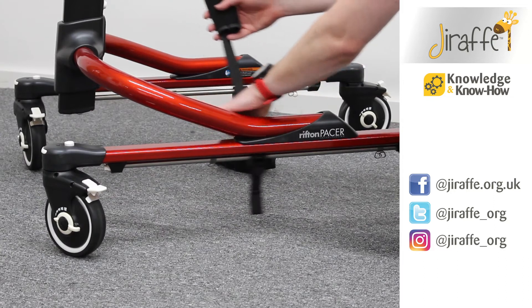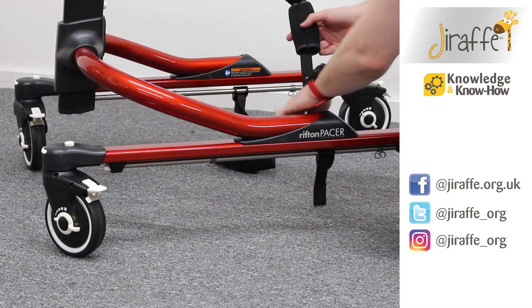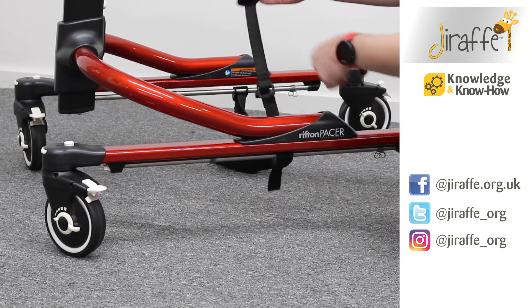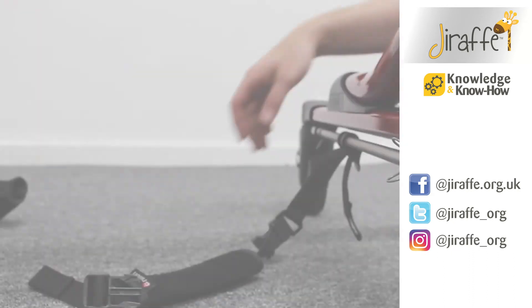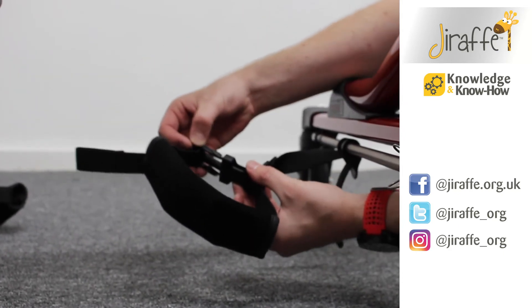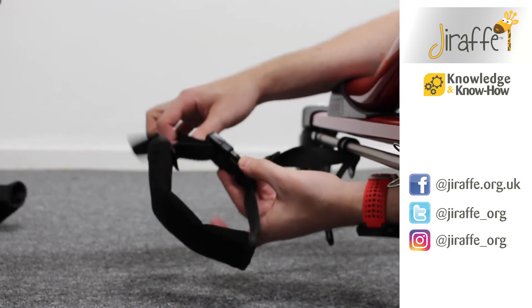The ankle prompt itself has got a clip that's going to go around the ankle and clip into place. We can also adjust the ankle prompt to make it tighter or looser.